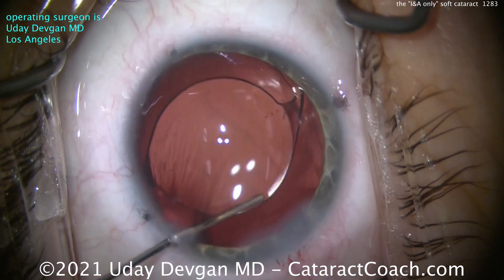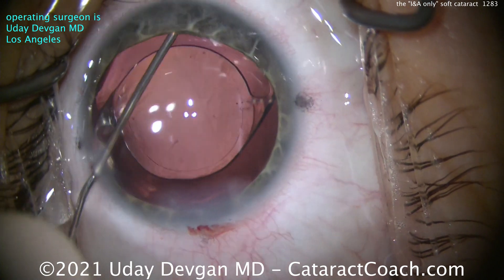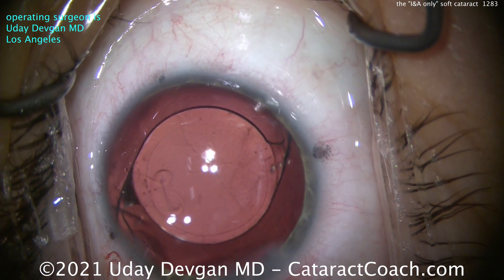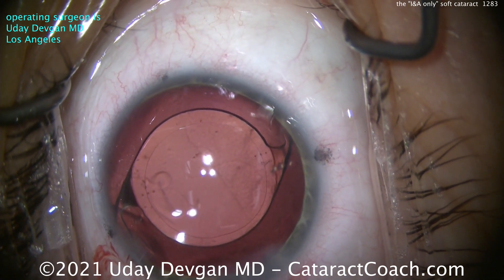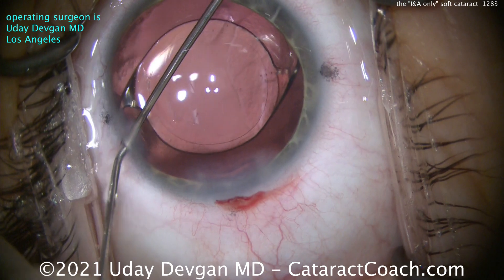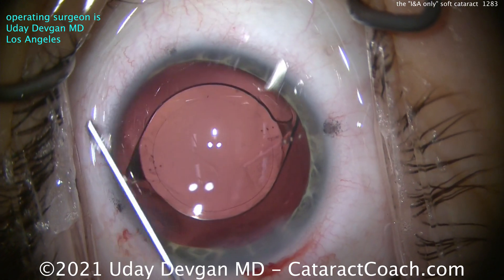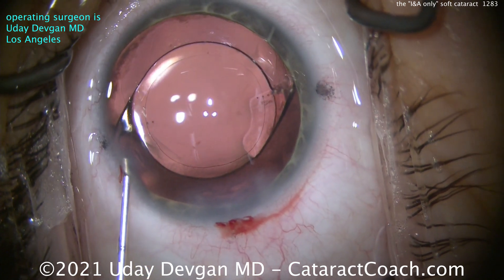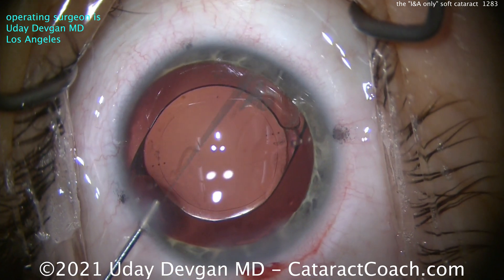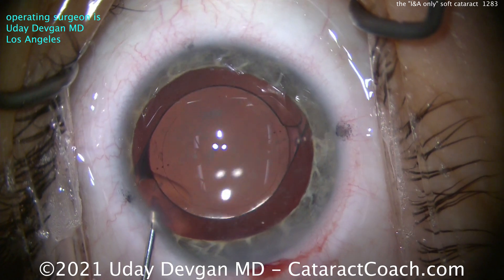Sealing up the main incision — you can see the REX looks great, about a 5, maybe a little bit more than 5 millimeter REX, nicely centered and nice and round. This is a high myope, so we brought the pupil back down a little bit by lifting up the iris. I really like that lens position. You can see on the right side of your screen, the patient's inferior cornea — there are some marks there. That looks great. So we're going to just wash out the viscoelastic and tent up that iris and seal the incisions.